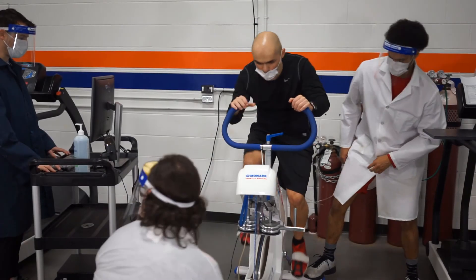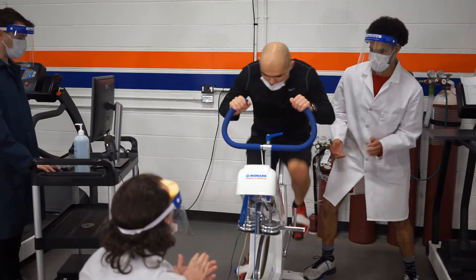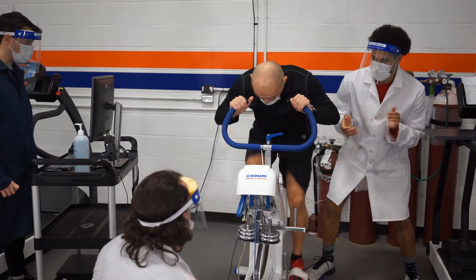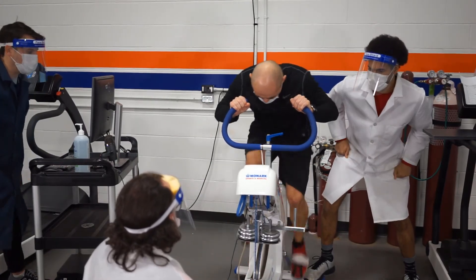Here's the same test clip from a second angle, so you get a better sense of what the experimenter in the back is doing — keeping a foot on the bike, encouraging the participant, and making sure the participant stays seated and doesn't rise above the seat.